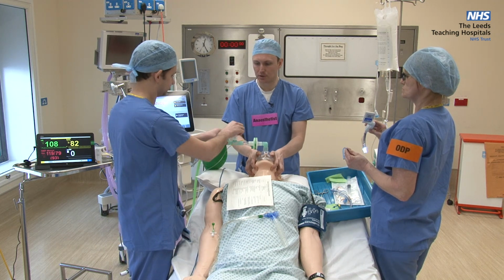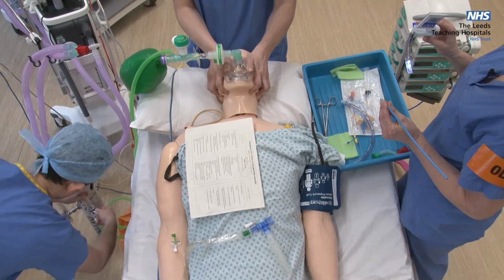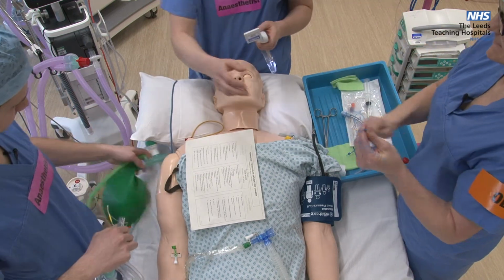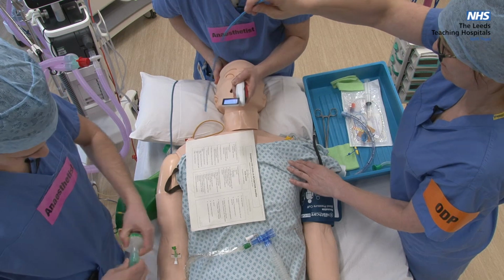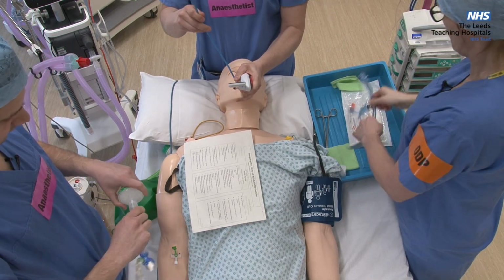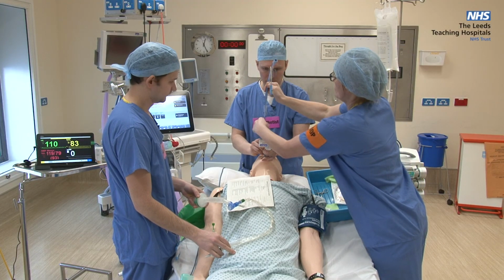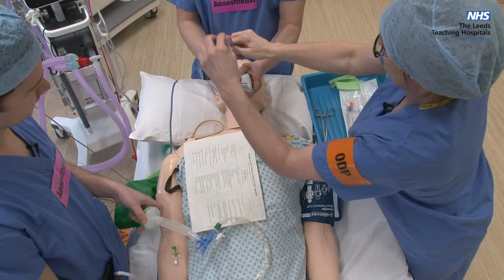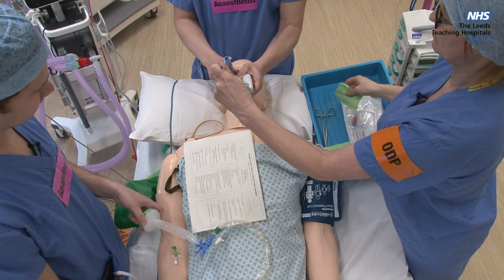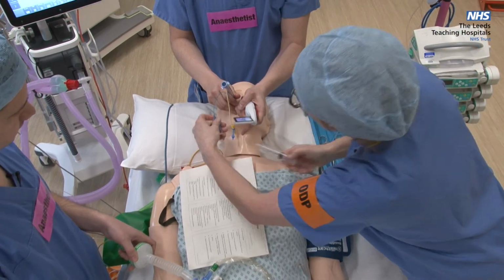So do you want to open the APL valve? APL valve open. Turn off the oxygen. Oxygen off. I'm going to give that to you now. Thank you. So epiglottis, chords, it's an easy view with the McGrath. Bougie through the chords. I have the tube. Tube through the chords, bougie out, please. Bougie out.